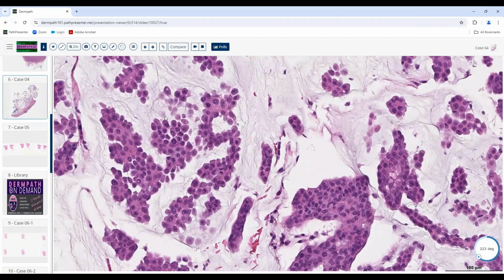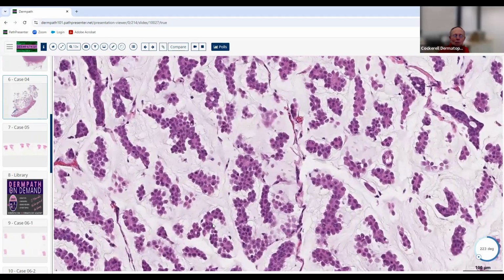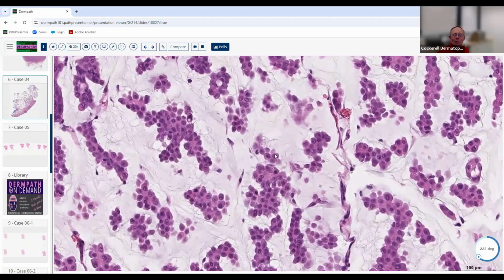Some people say that my old mentor, Dr. Ackerman, used to claim that just about every lesion thought to be eccrine was really apocrine, because you could always find one or two cells that looked like they were doing decapitation secretion. I don't know what that means, whether it's eccrine or apocrine, but certainly it puts it in the adnexal eccrine apocrine category, possibly.